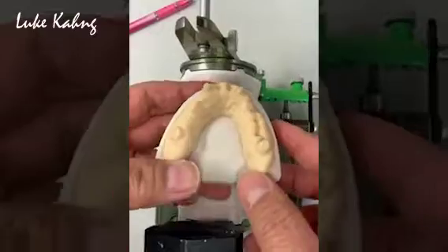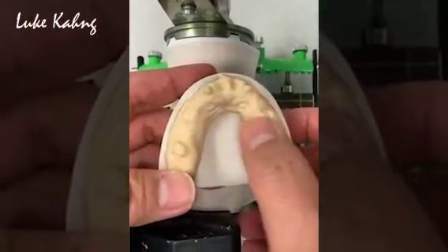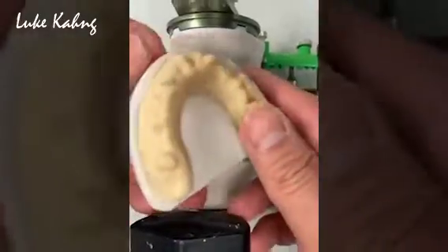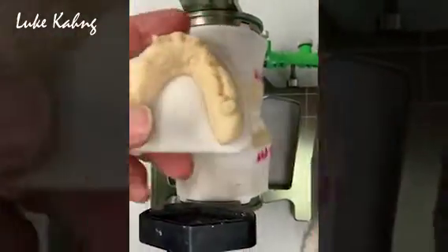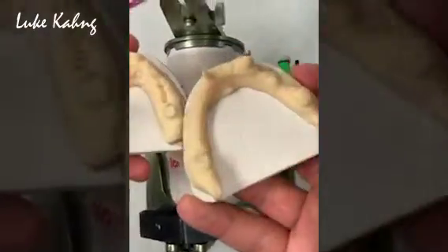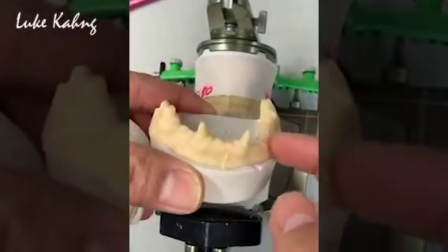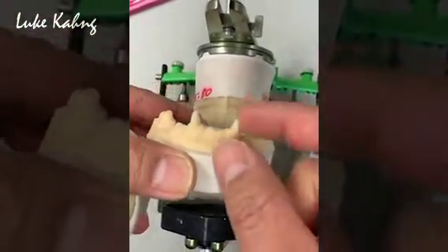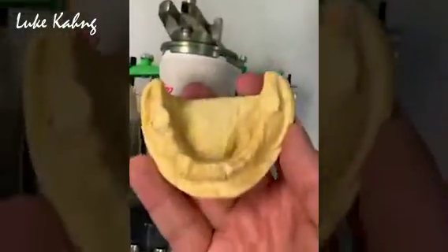Here's the story: the patient doesn't have any teeth. This is temporary, before they go to the implant stage — they want something in the patient's mouth. So here's upper, here's lower — pretty interesting case. We used a 3D printed model from Invisit Tag, which is good because it doesn't break. The dye breaks all the time, so I prefer the printed model over that — all the dyes broke.